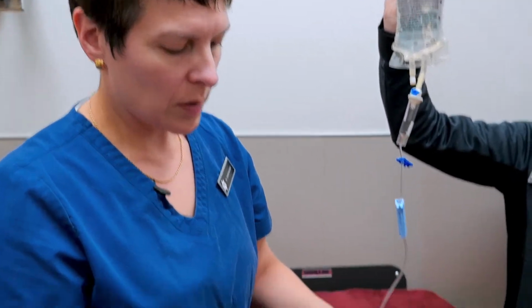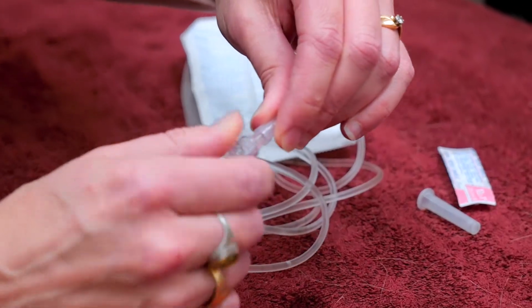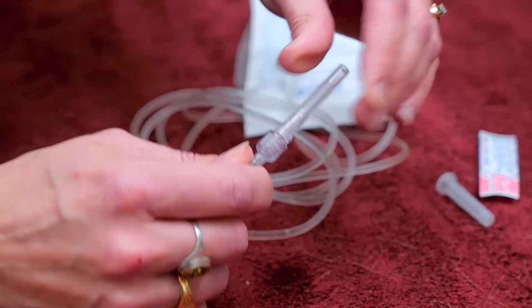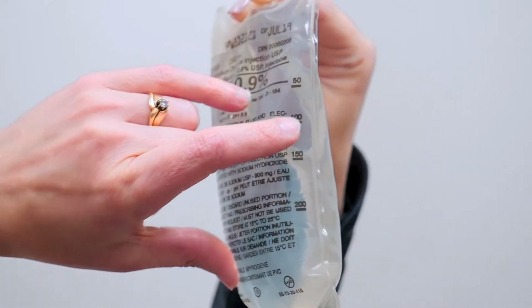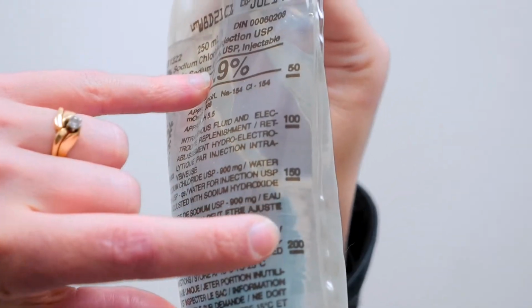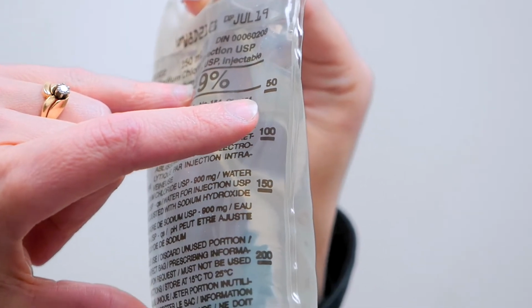fluids. We're going to put this needle on the very end, and then you can secure that with this little locking device that twists up on the bottom there. And then this bag is ready to administer fluids. If you'll pay attention to this little marking on the side here, you can actually see where volumes are measured on the bag, and that's how we control and monitor how much fluid we're actually administering.